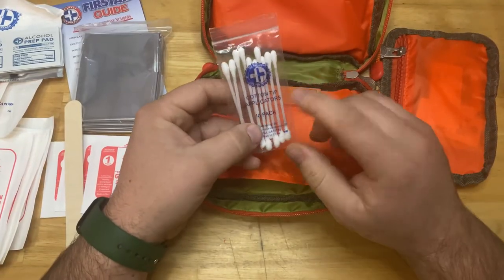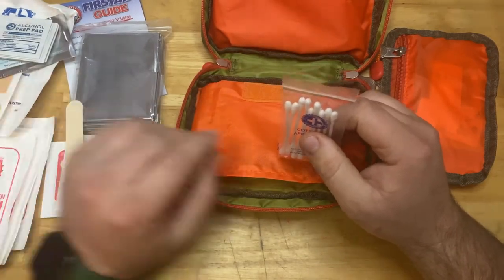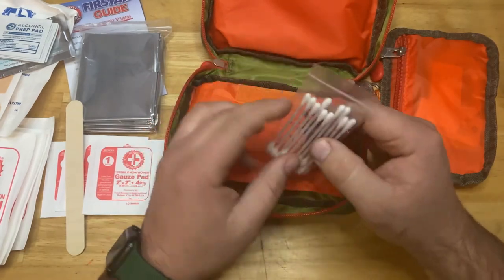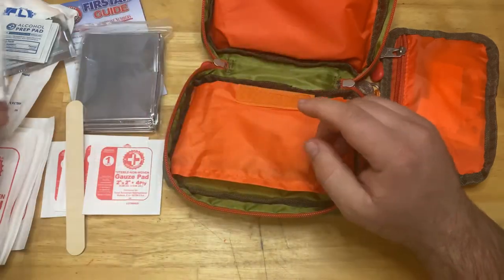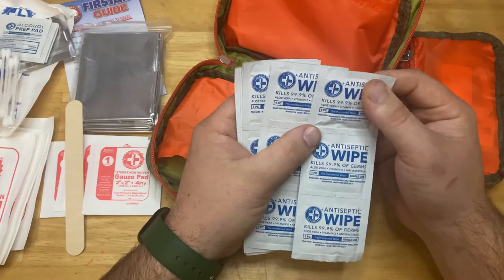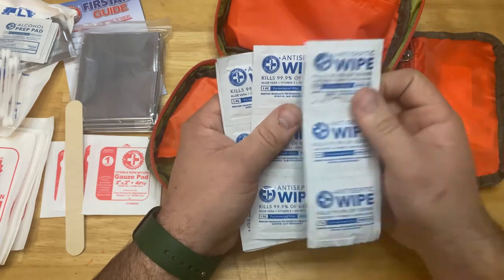There are Q-tips — cotton tip applicators — which are great for applying ointment when you don't want to touch someone else's wound directly. You could also use them to clean out your ears or if you have something stuck in your eye. Then there are antiseptic wipes — these are like large hand towels, pretty large — about nine of those.